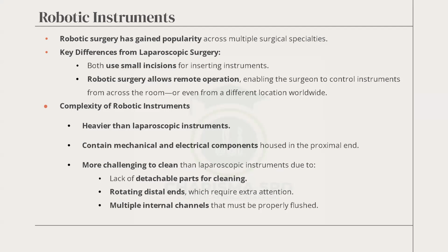across multiple surgical specialties. Most of it used to be abdominal. Now you can get thoracic cases with robotics going in there. Maybe along the line we'll see some of what we are talking about.